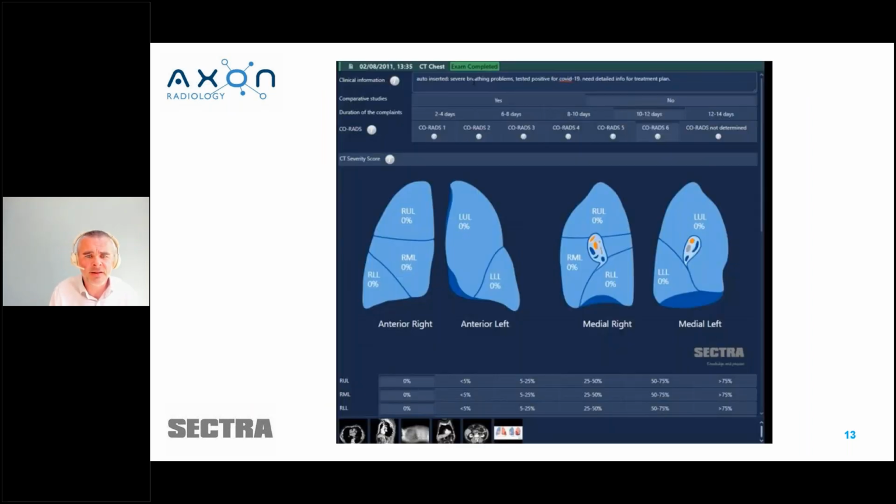And to Moira's point earlier, around the use of standardization and harmonization, reporting within PACS opens up a wealth of possibilities, really. The capability of leveraging the Sectra structured reporting framework, for example. Novel reporting templates can be created to standardize reporting for conditions that might benefit from this type of structure.